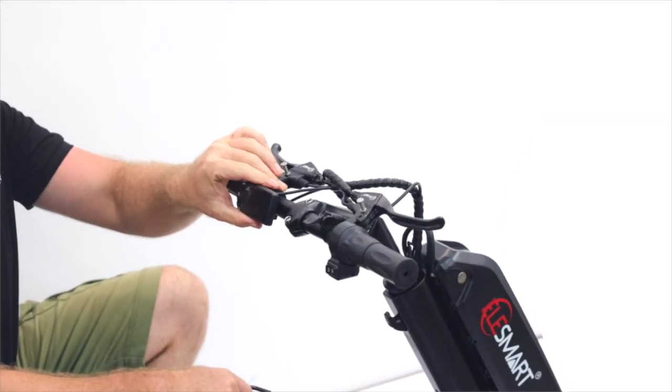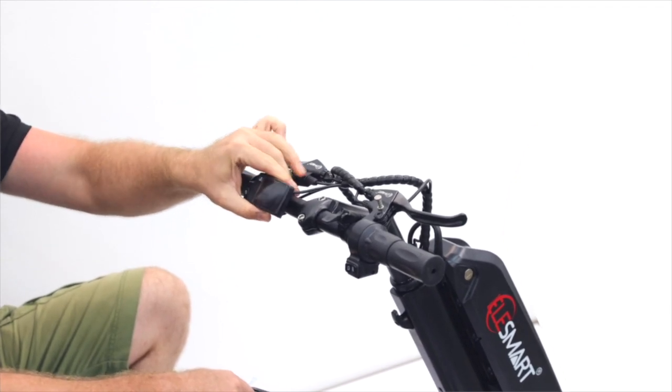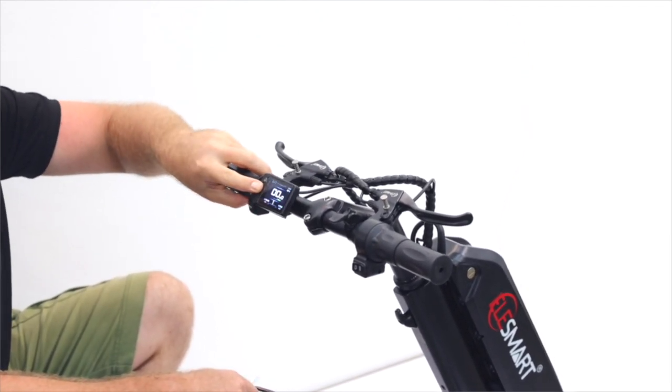So one little tip, we have a display here and we can adjust that up or down depending on our point of view. So we can either bring it up or bring it down, and then we turn on the whole thing and we're ready to go.